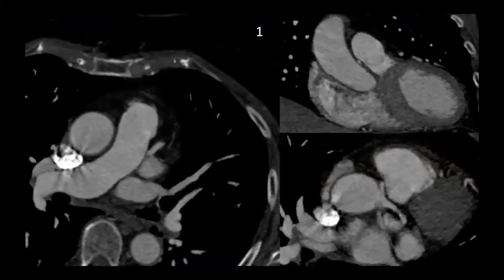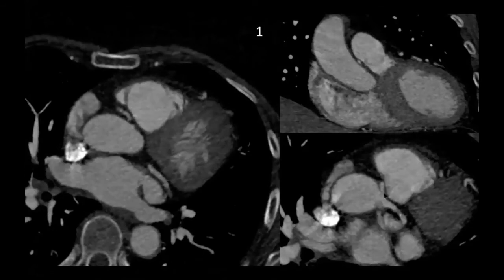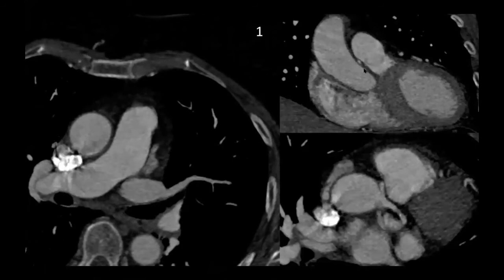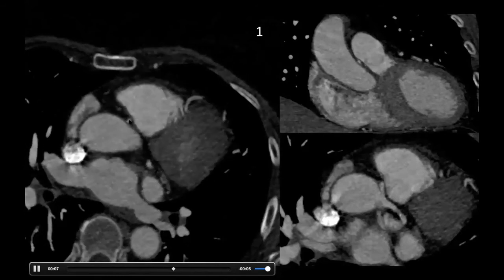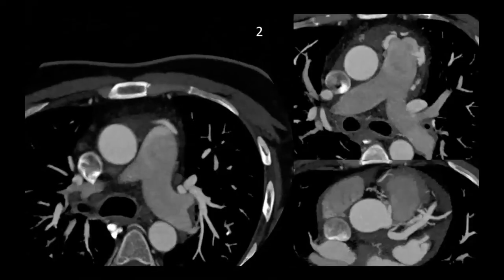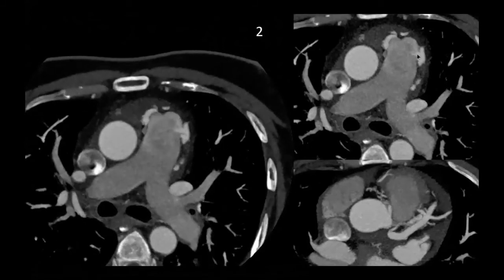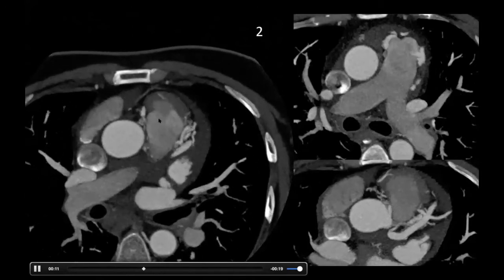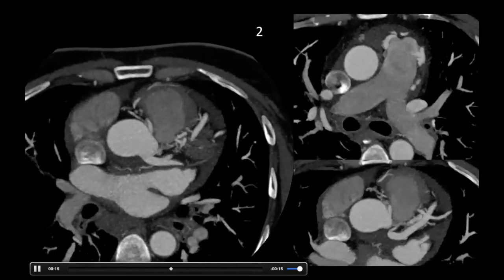Let's look at some cases where CT is extremely useful. This patient has an anomalous origin of the right coronary artery from the left cusp with an interarterial course, which can be nicely traced. You can see this is the left main and this is the right coronary artery arising and coursing between the aorta and the pulmonary artery. A different patient shows grossly dilated coronary arteries with a fistulous communication between the coronaries and the pulmonary artery — something very nicely depicted on CT.